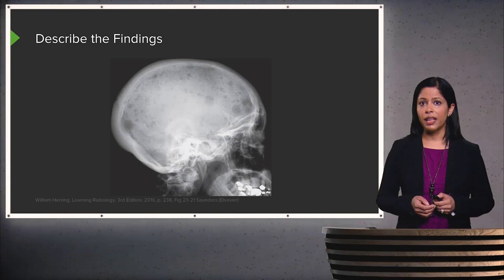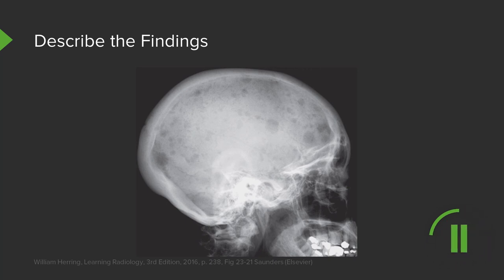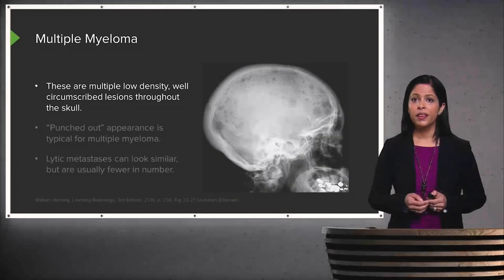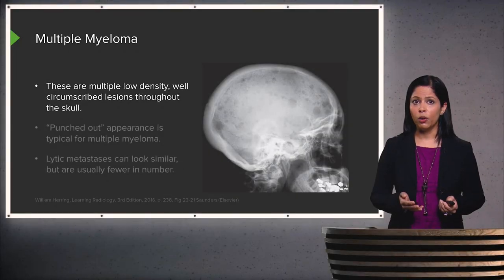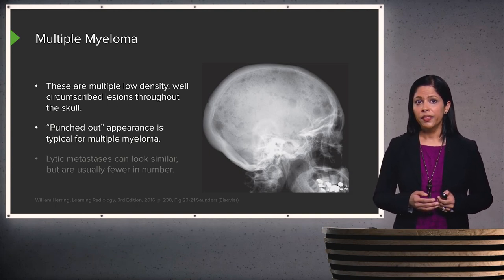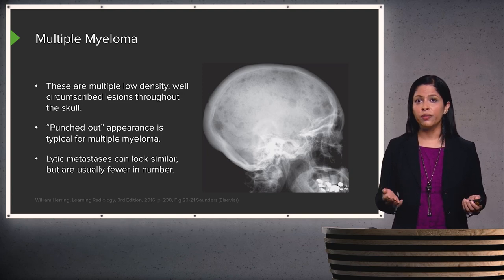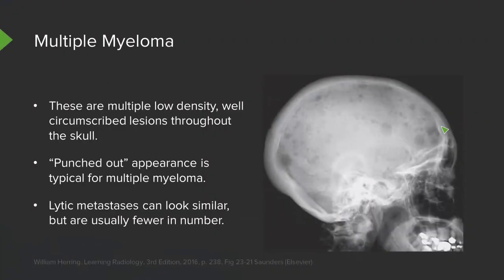Let's take a look at this lateral view of the skull. This is an example of multiple myeloma. You have multiple low-density, well-circumscribed lesions throughout the skull — a very typical appearance called the punched-out appearance. Lytic metastases can look very similar but are usually fewer in number. You can see multiple lucent lesions of all different sizes scattered throughout the skull.